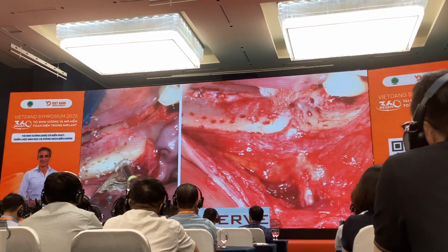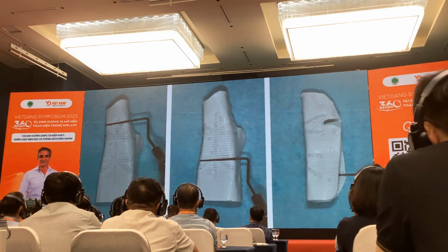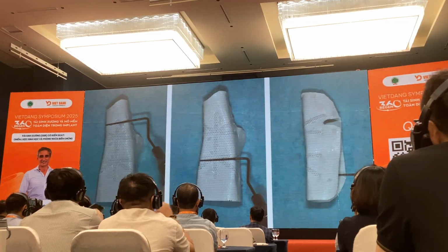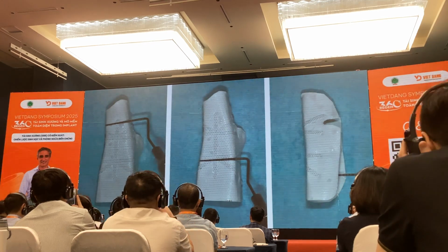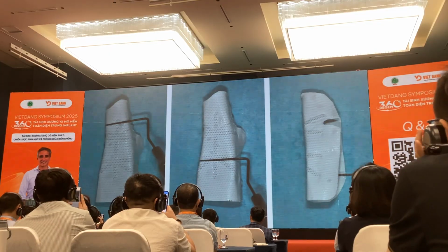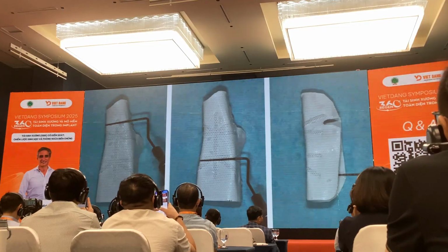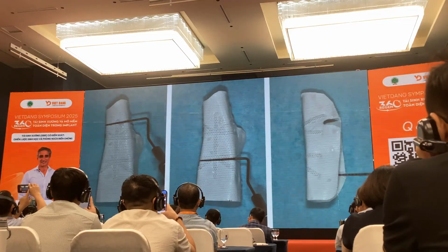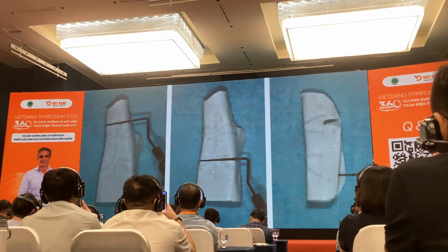I perforated the bone, I shaped the membrane, 10, 14 millimeters. I defined the shaping with the dental probe, no random. I wanted to add a specific dimension of the width, and so I modified the titanium further using the dental probe.